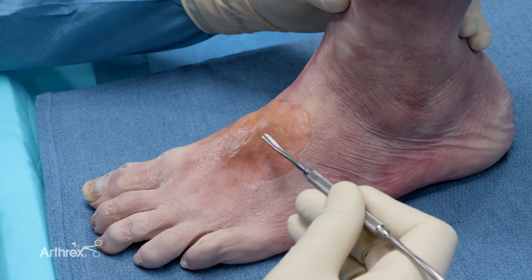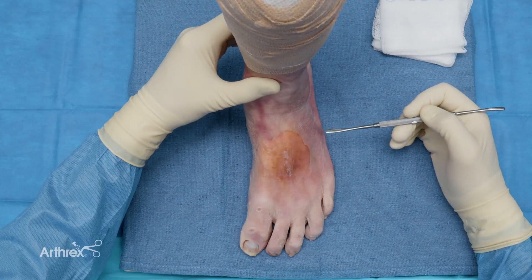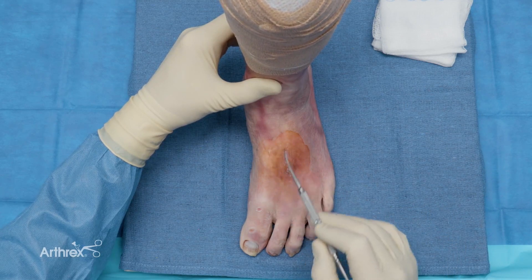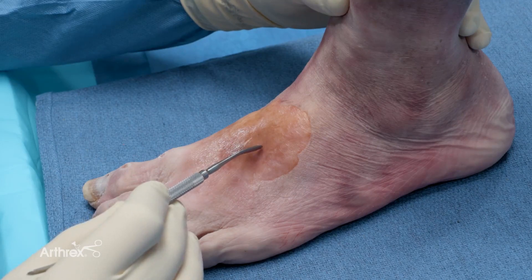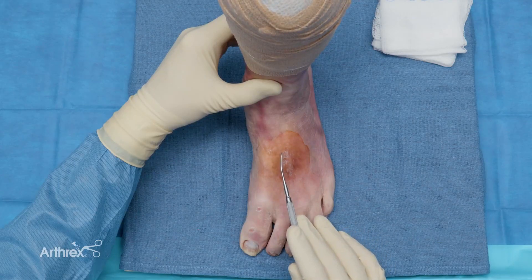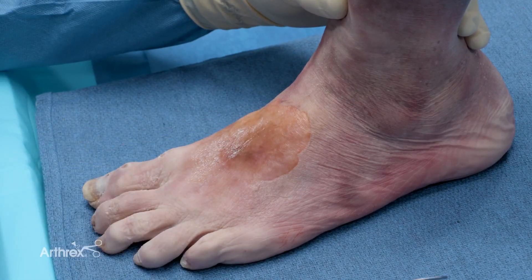If they have significant instability in the sagittal plane, then a diamond-shaped Lisfranc plate can also be utilized. This plate would allow fixation or stability of the first ray and the second ray. The incision for this portion would then be moved from this lateral base to more primarily over the second metatarsal. That allows you enough soft tissue protection of the neurovascular structures when you elevate to then place that plate for your sagittal plane fixation.